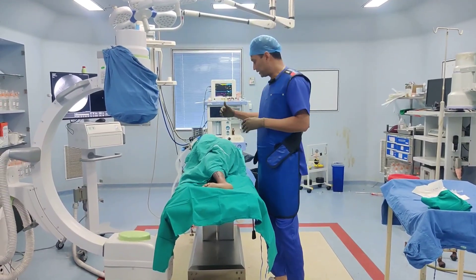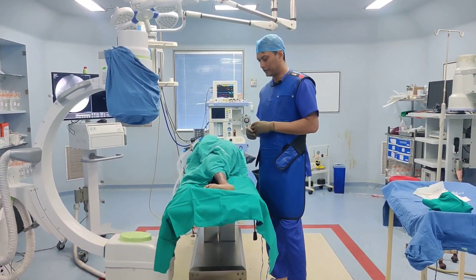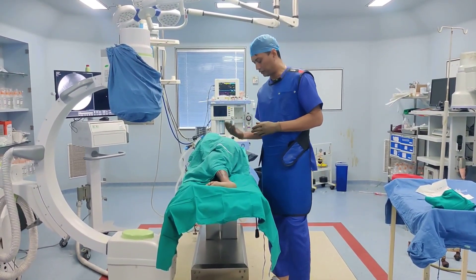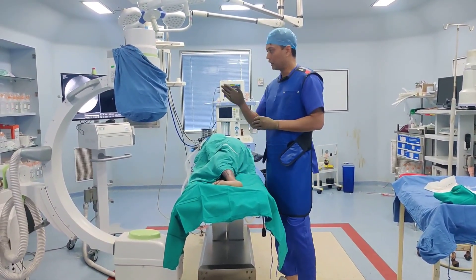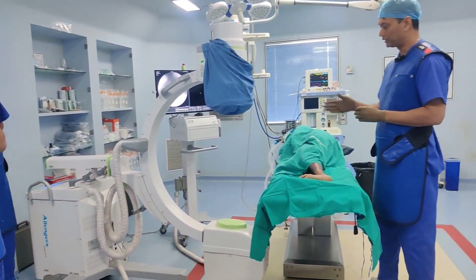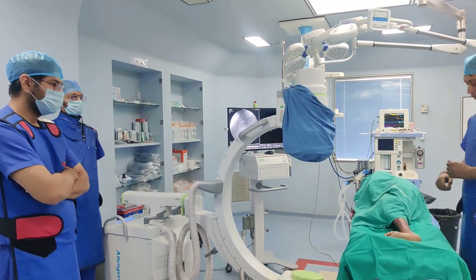This is our setup — the patient is in the lateral position. We are injecting the left side, so the patient is on the right lateral. We are going to enter from the lateral side. The C-arm is going to come from the opposite end, and the C-arm screen will be right in the front.